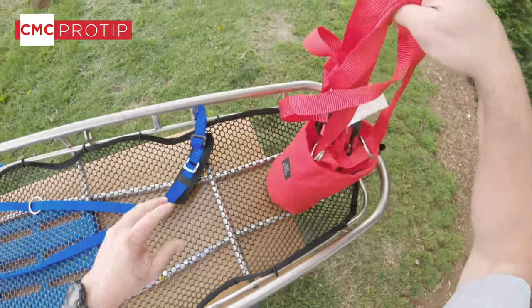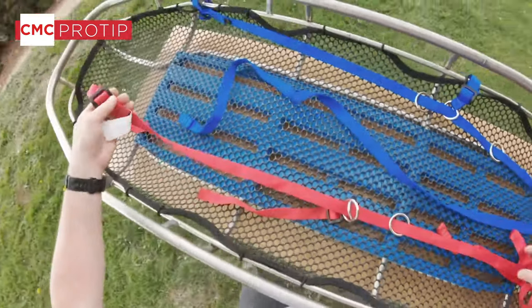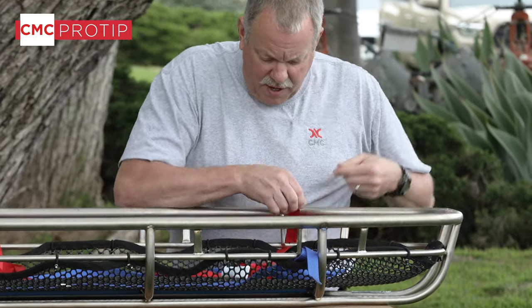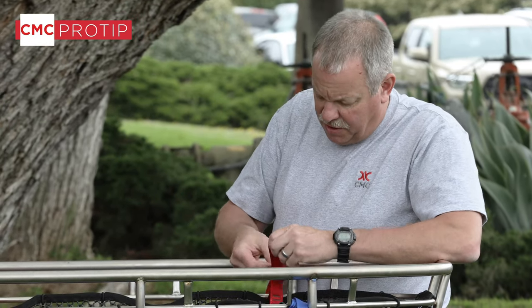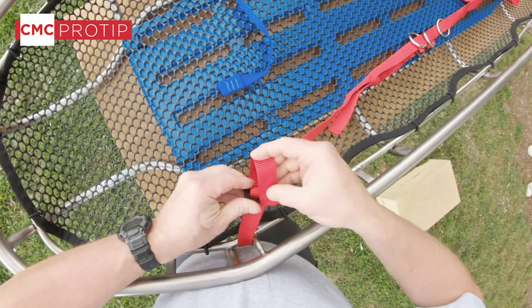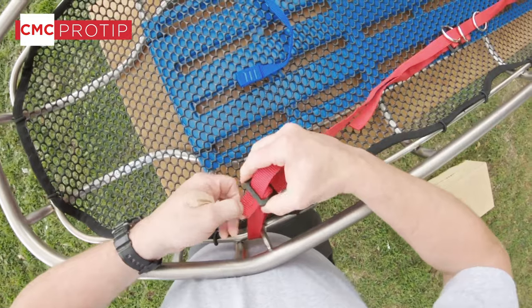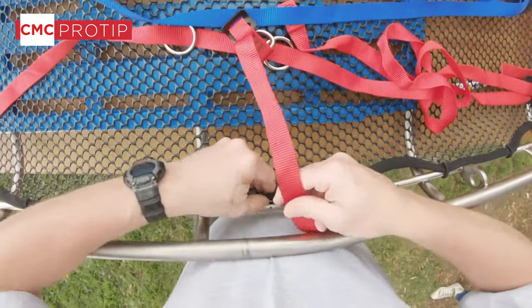We're set there, so we'll go ahead and take our second strap now. Many teams have used one-inch tubular webbing for the same type of patient tie-in with lacing and improvised harnesses, and it does work well. However, a pre-sewn patient tie-in system such as this — especially when pre-rigged as we're doing — makes it much faster and more efficient for the rescuer to package the patient.